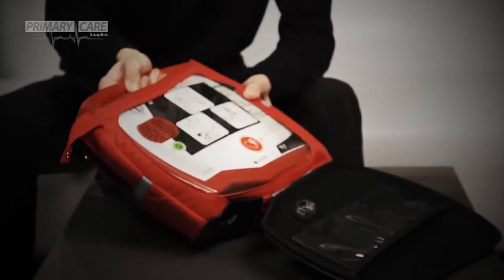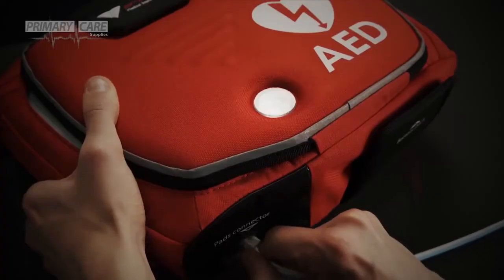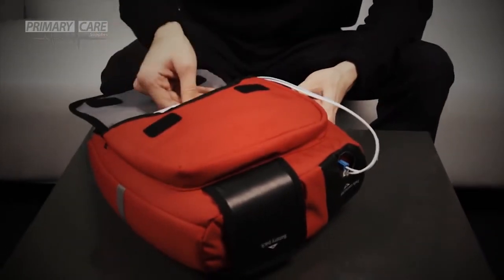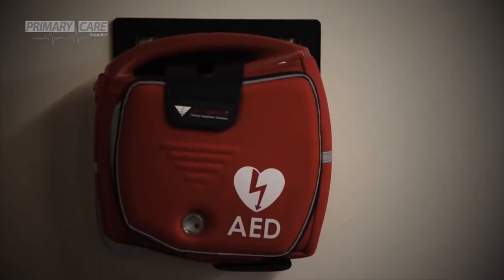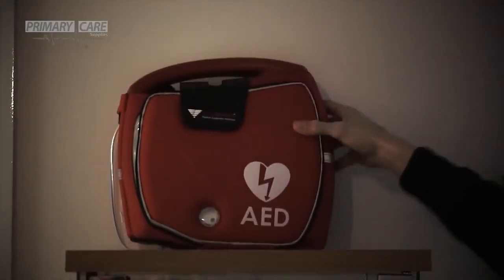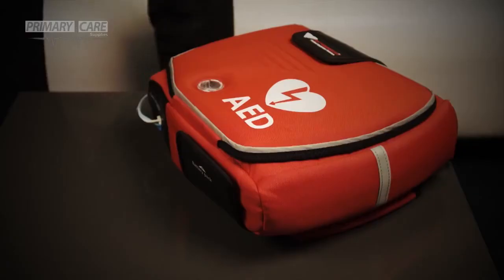After the test is complete, slot the defibrillator into the protective bag. Connect the adult pads and slot this into the accessory pouch. The defibrillator is now set up and ready for use. It can be mounted on the wall, kept in a purpose-built cabinet, or stored in a convenient location in its bag. A green status light flashing on the front of the machine indicates that the Rescue Sam is in standby mode and ready to be used.